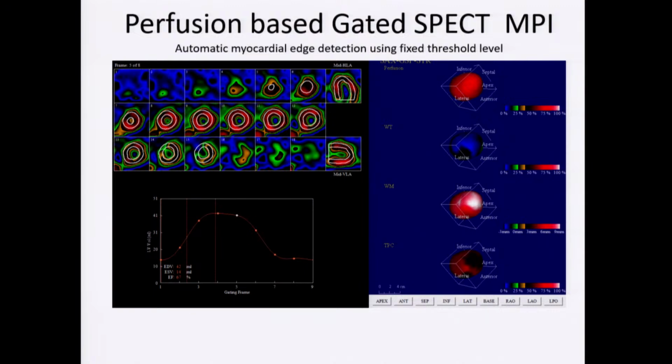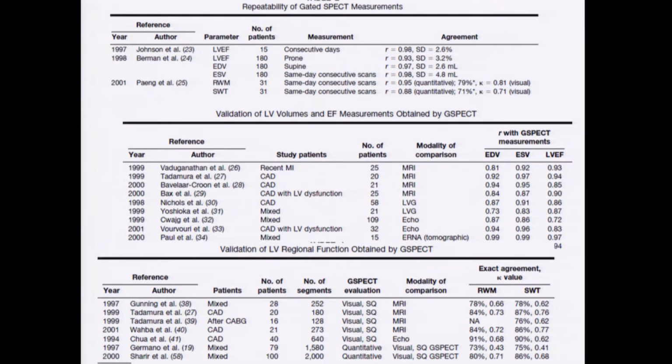Much larger volume, multiple areas with decreased count activity, low ejection fraction. The key here is it is very reproducible, okay? We're not talking about accuracy or how precise. It's very reproducible, meaning that if you do it every single time, unless a patient had horrible arrhythmia, you're gonna get a very good EF number, okay? And across readers, essentially, there's very little variability, unlike, for instance, echo, right?